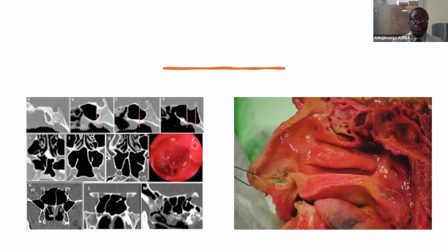The images show CT scans of various types of sphenoid sinus. The top panel shows the sagittal view of the types of the sphenoid sinus. The middle panel shows the coronal view, displaying the lateral pneumatization and the location and orientation of the septum.